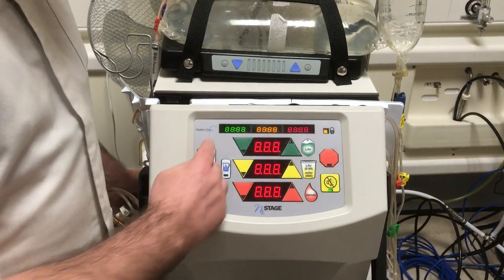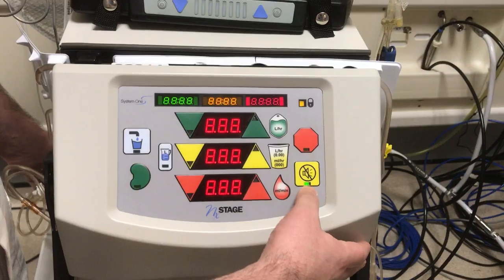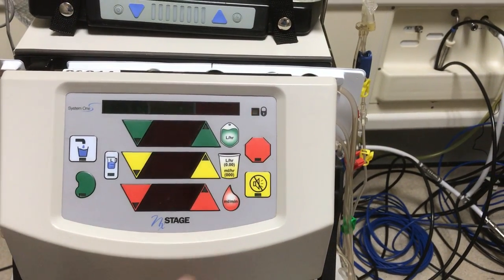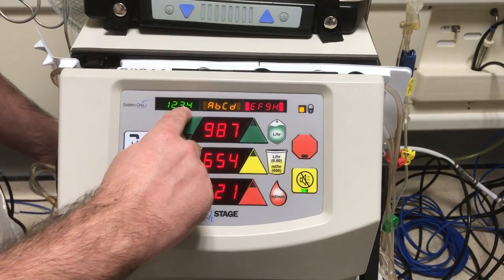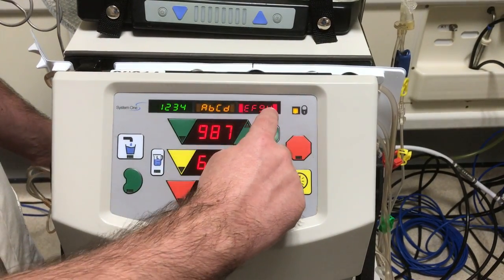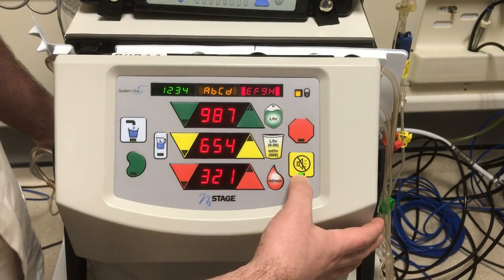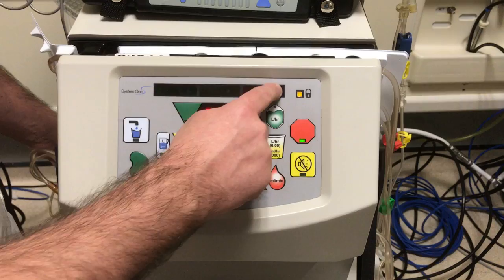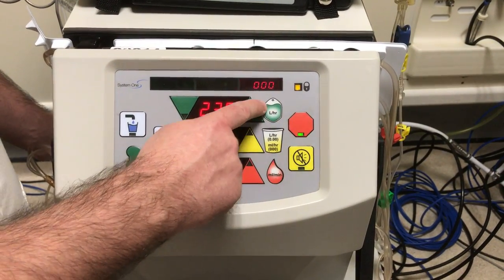Once the prime is complete you'll get the series of eights. You need to press the only button that's lit, which is the yellow mute button. The machine will then tell you one, two, three, four, A to D, E to H, and nine down to one. You can press the mute button again which is lit and then you will get the three zeros. The stop will be lit but do not press the stop.